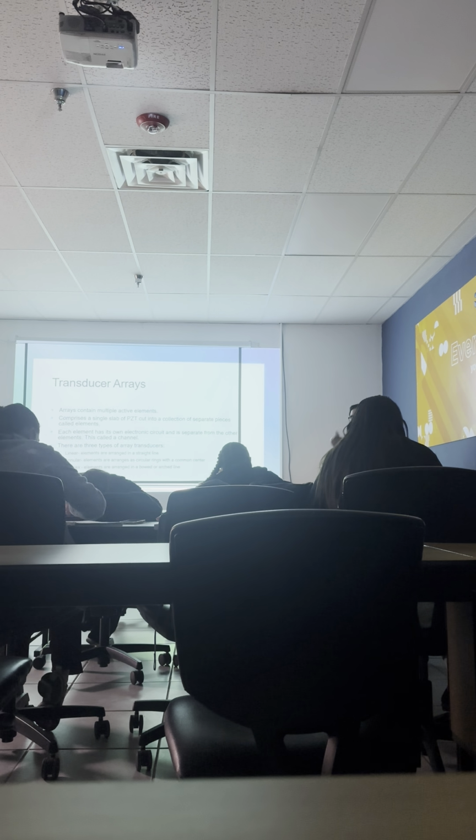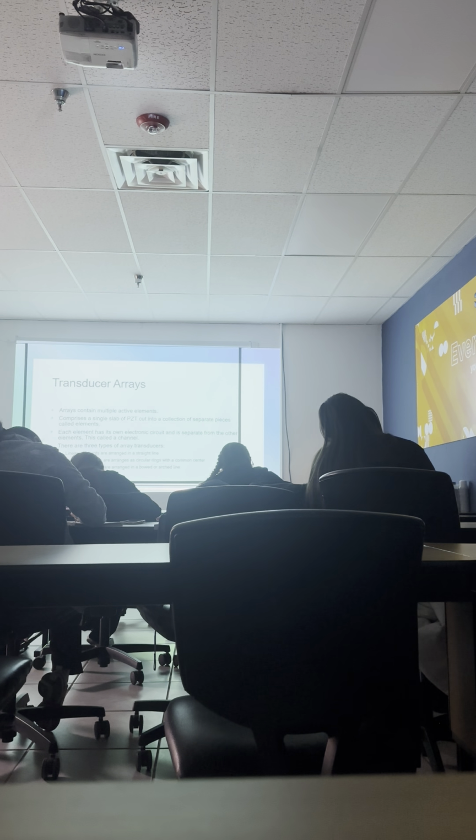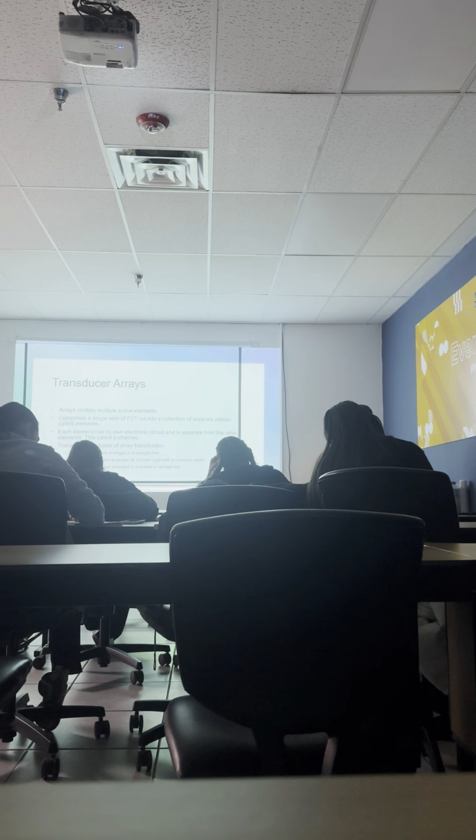I have a question. Yes. For the crystals, are they all the same size? It depends on what type of probe it is, right? What are the two elements that determine the frequency of the probe? The speed and the thickness. Yes, the crystal speed and the thickness of that crystal, right? So a linear probe will have a different size and a different propagation speed.